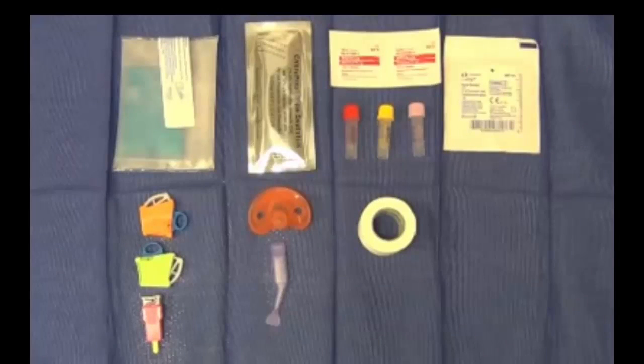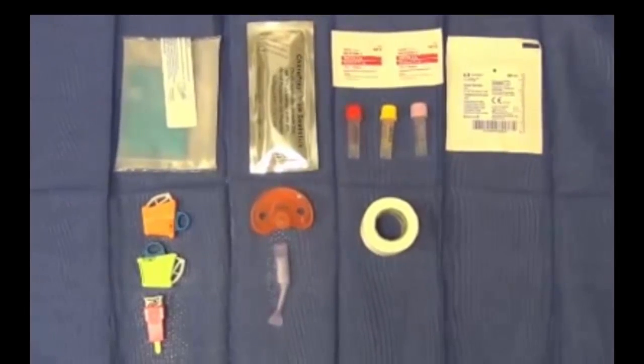Limitations of capillary blood sampling are encountered when blood cultures are required, coagulation studies are required, the volume of blood exceeds 1.5 mLs, or when minimal amounts of hemolysis will alter the validity of the laboratory value being assessed. The equipment required for capillary blood sampling is as follows. A heel warmer is utilized to promote vasodilatation and increase the blood supply to the region.